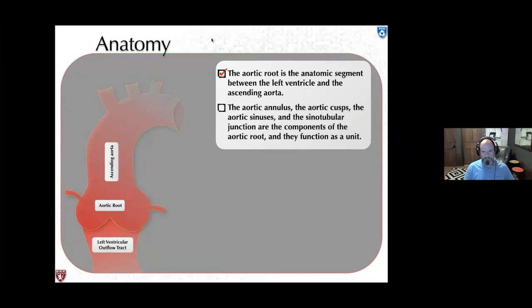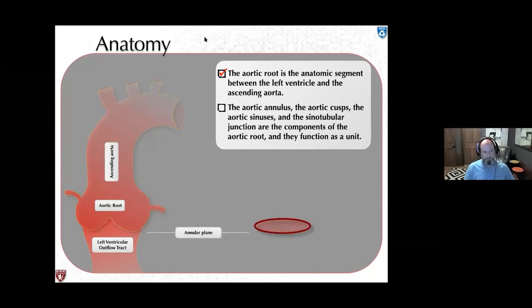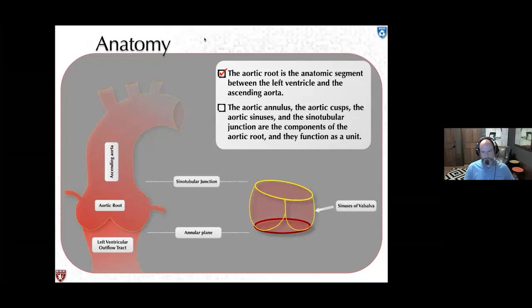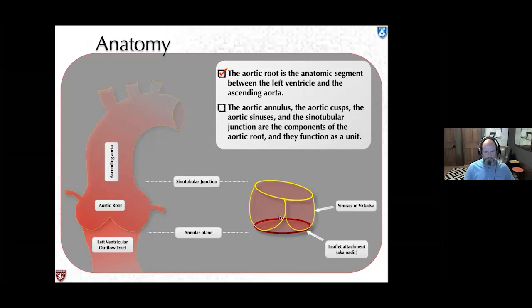The aortic annulus, the cusp, the sinuses, and the STJ are all components that function together as a unit. Here's the annular plane, which is the measurement that defines the aortic root. Here's the sinotubular junction, and here are the sinuses of valsalva in between. The lowest part of the sinus of valsalva is called the nadir — the lowest point. For TAVR annulus measurement, we want to be one slice below the nadir when we take our measurements; we look for the nadir of each cusp.